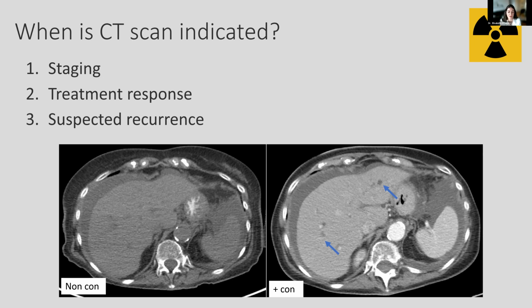Radiation-wise, the radiation exposure, through new technology which has been around for the last 15 years or so, means that we can really reduce the dose. So the dose for each CT is probably about 4 times what you get from background radiation, just from living your life in New York City or wherever you are in the world. There's always a small amount of radiation. So we don't want to be doing them every day of the week, or even every week or every month, unless it's indicated. But the radiation dose is significantly lower than it was in the early 90s, when it was a real concern.